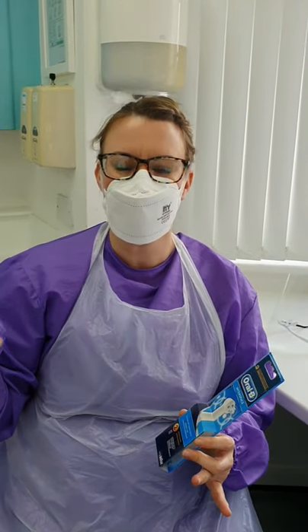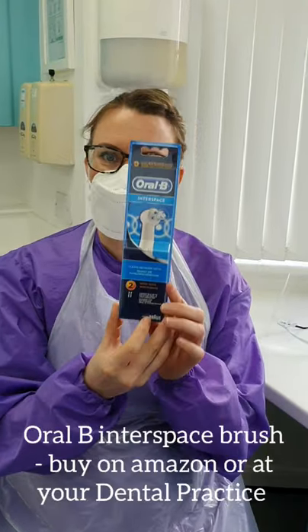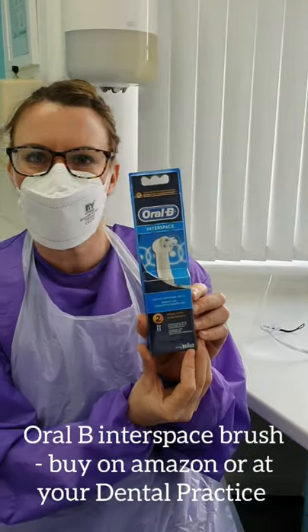Hi everyone, it's Naomi here, hope you're all well. I'm just in practice now and I've got a patient in the chair. The patient has consented but we're not going to show this person's face. I just wanted to demonstrate these brushes today, so I talk about these quite a lot.